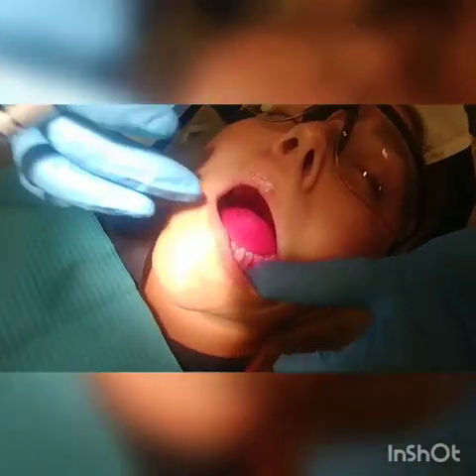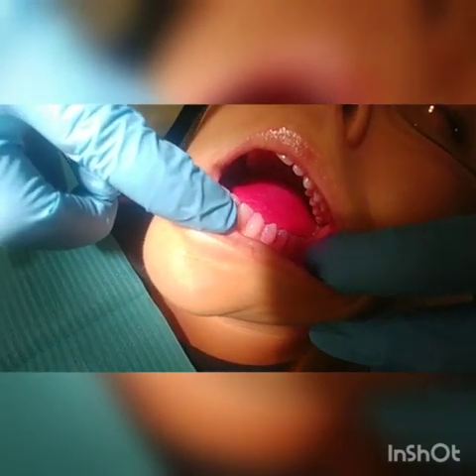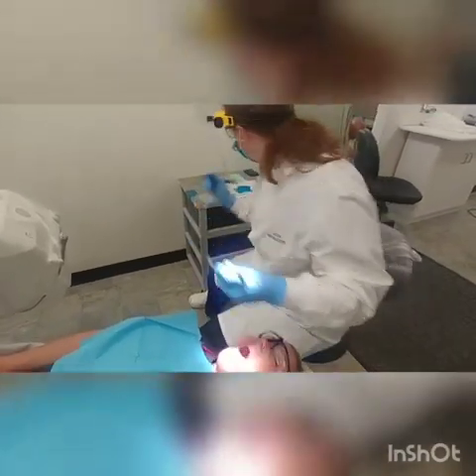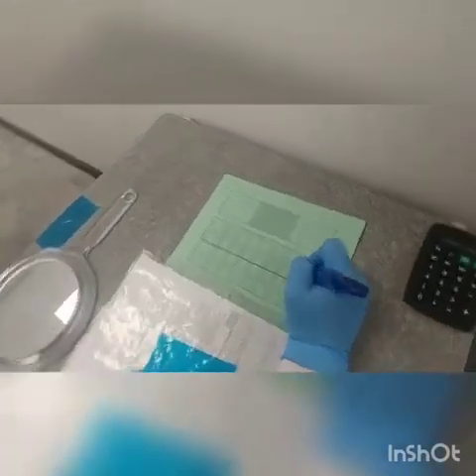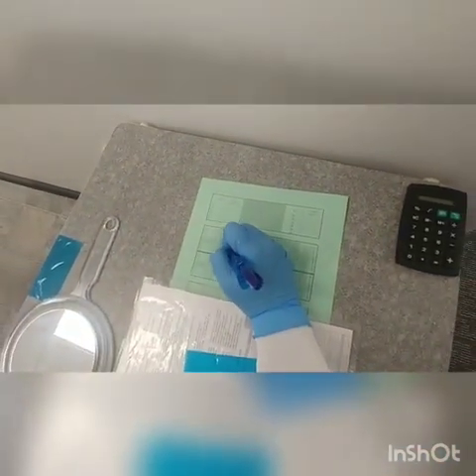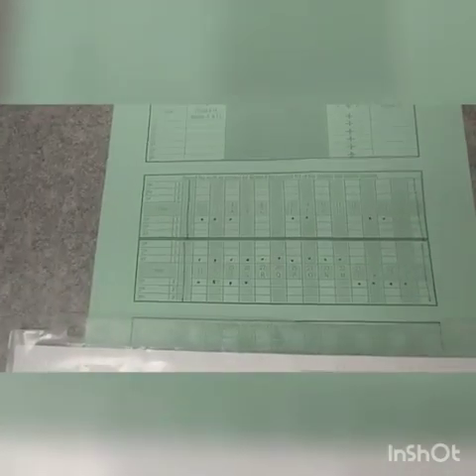We can just go down here. So down here we can see these would be positive marks on the buccal surface of these posterior teeth here. So our clinician right now is checking all of the teeth, and then she'll turn to her paper. She'll put little dots on every tooth surface that has a positive biofilm mark. Remember that we're looking at the maxillary, the mandibular, and then facial and lingual surfaces are written on the paper to show you where to mark.